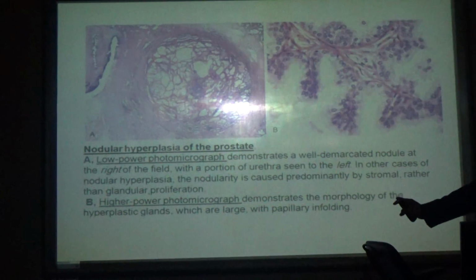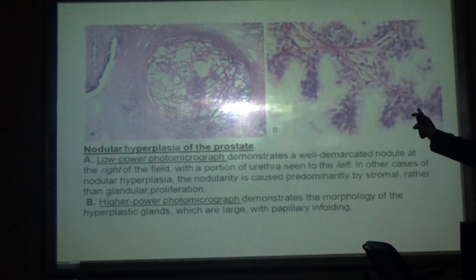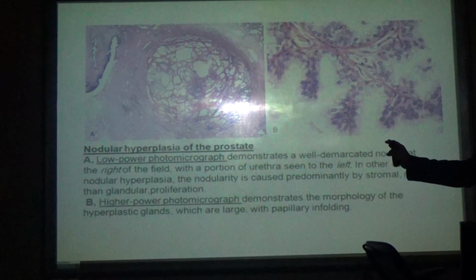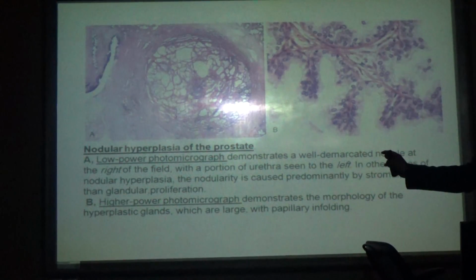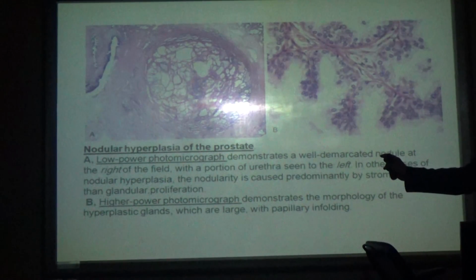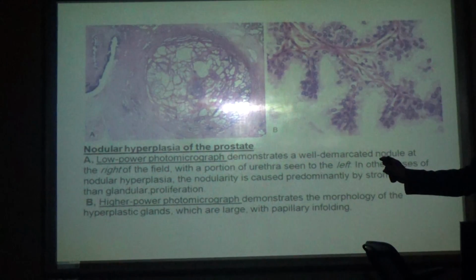See, the clue is: the prostate secretes some secretions, right? What are the secretions? Prostatic fluid. What is that fluid? A proteinaceous fluid. It is the corpora amylacea, right?